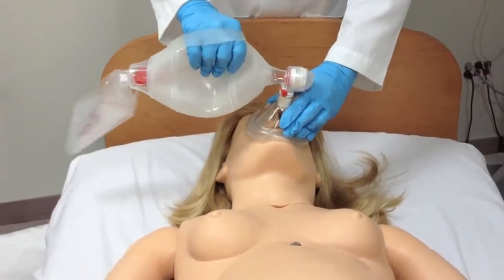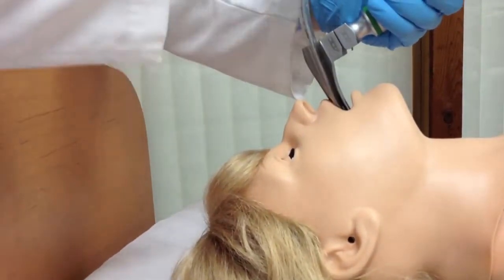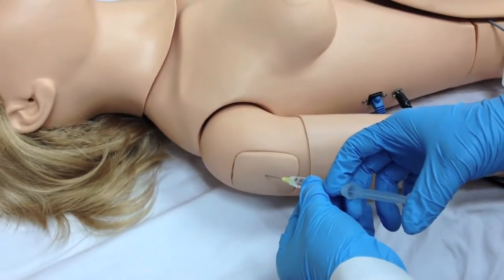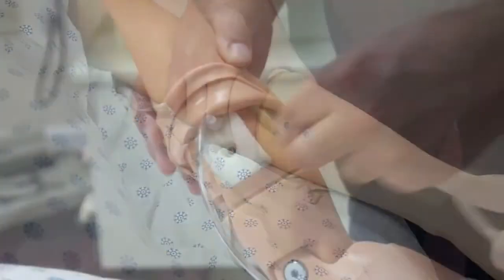In both cases, the mom is fully capable of BVM, CPR, and intubation. Both have bilateral IM sites in the shoulders and thighs. They also include an IV arm, so you can do life support protocols.